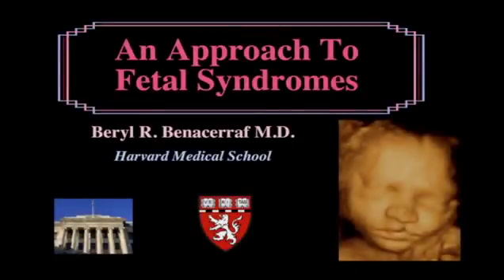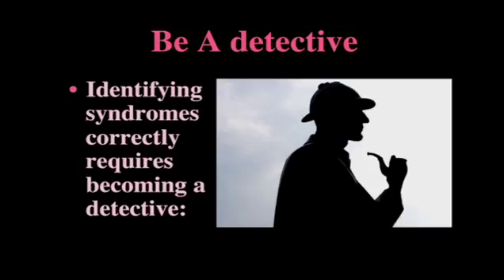Well, today I'm going to be talking about my approach to detecting and identifying fetal syndromes, which is a very complex area since there are so many hundreds of syndromes that it's sometimes hard when you're doing a prenatal ultrasound to decide which syndrome it is that you're really dealing with.